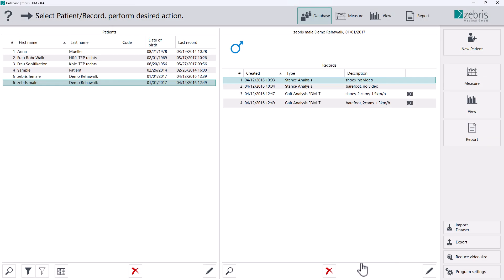Please note: Reducing the video file size can be done only once per capture. If you select it again, no additional storage space will be released. The compression process may take longer depending on the file size and cannot be aborted. The compression process cannot be reversed.